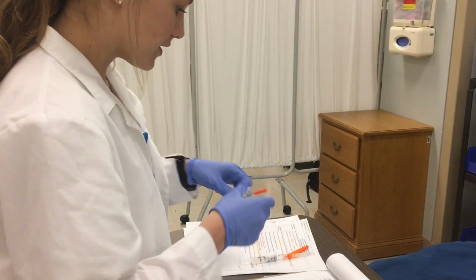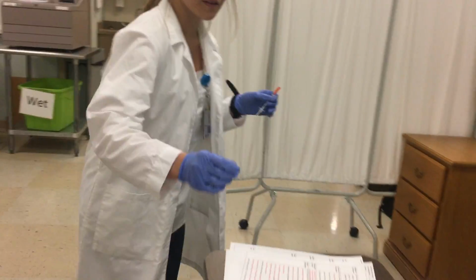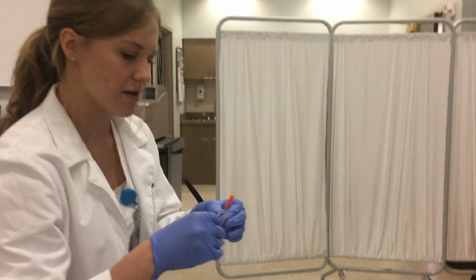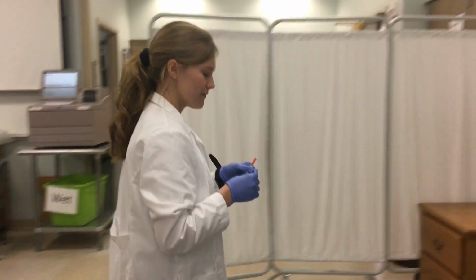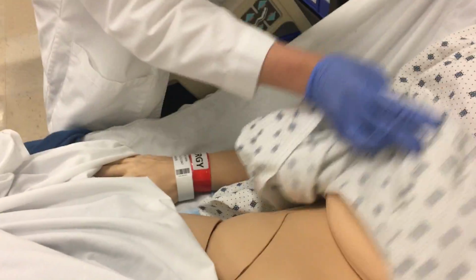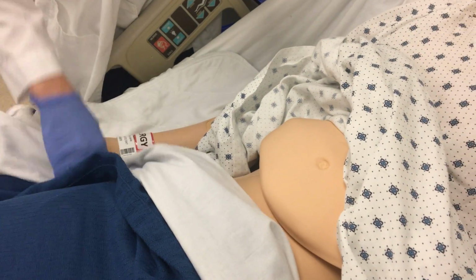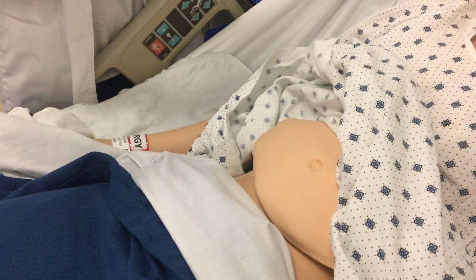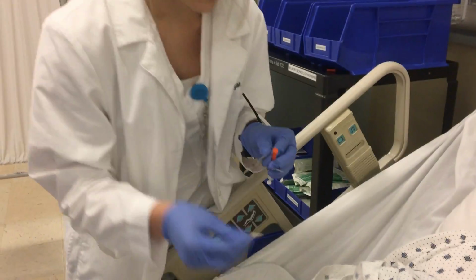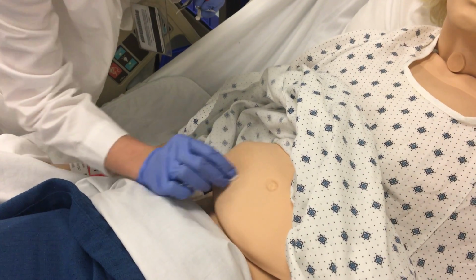I am now going to administer my insulin, and it is subcutaneous, so it is going to be administered into the abdomen. And this again is to help with hyperglycemia. And I'm going to ensure patient privacy. And I am cleaning the injection site in a circular motion, in to out.